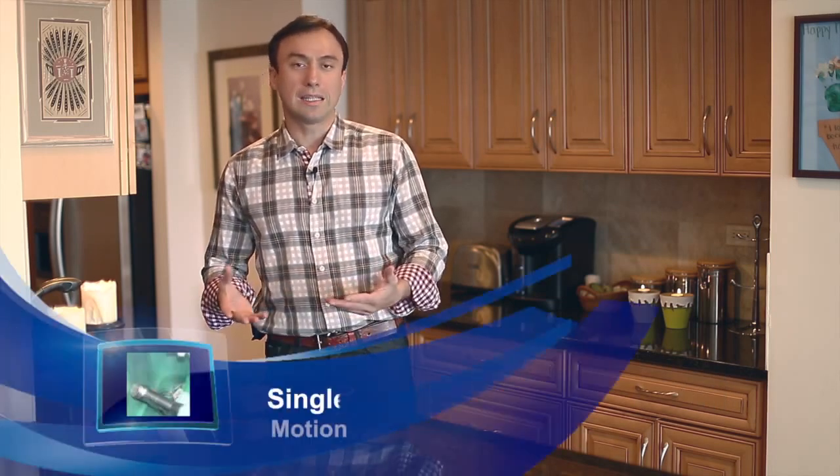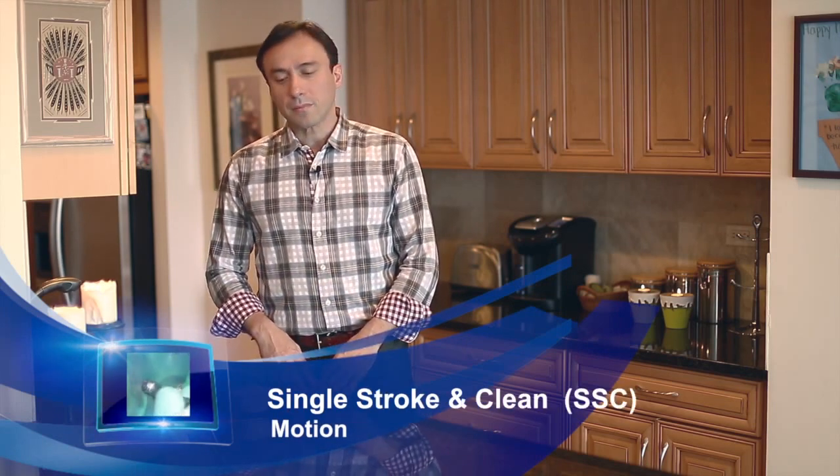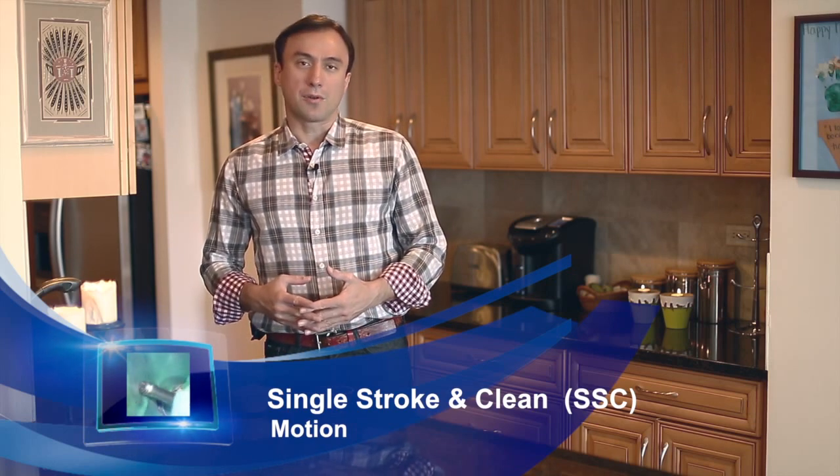Hi folks, this is Ali Nesse and I'm here today in my kitchen trying to demonstrate a novel motion in endodontics called the single stroke and clean technique. My goal here is to demonstrate how endodontic files have been used the wrong way over the past 20 years — the rotary files — and that a new motion is required to make them more effective and efficient.